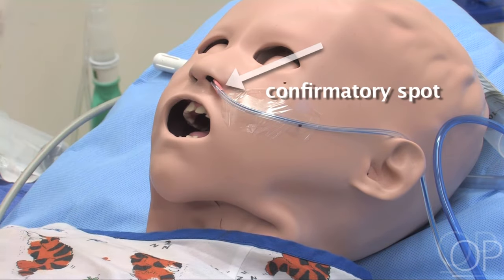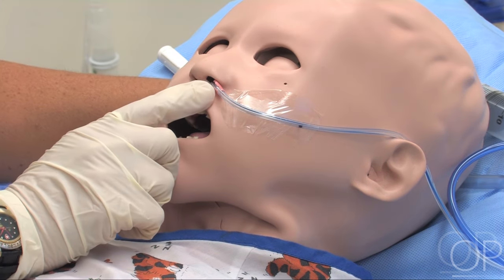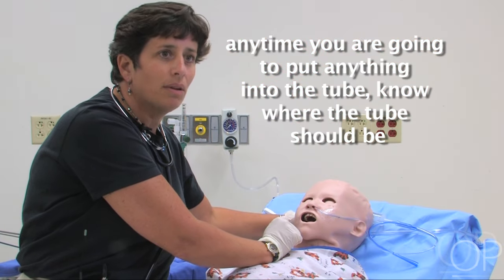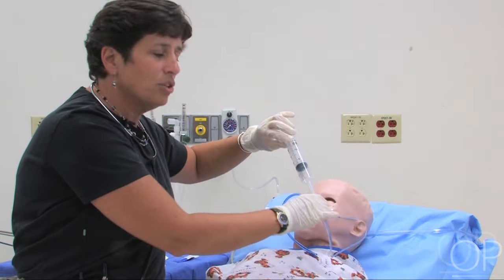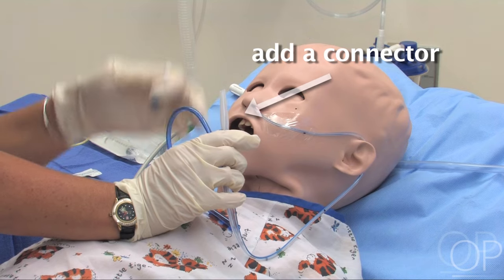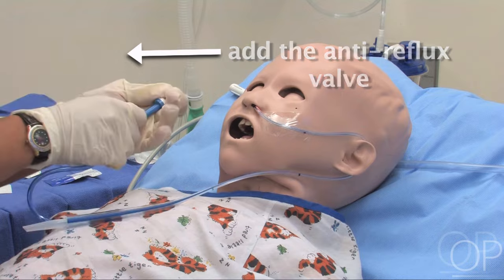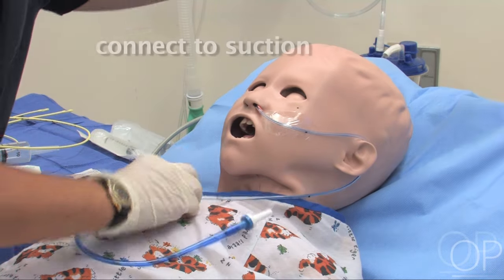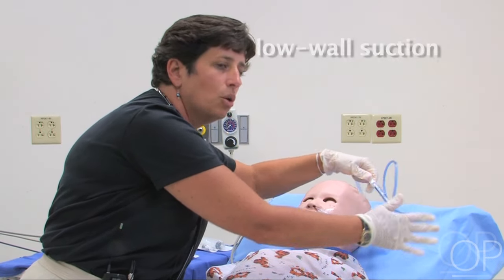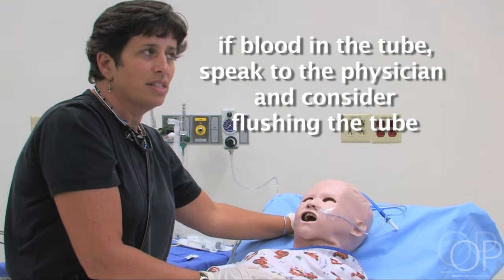As you can see, my confirmatory spot is right there, and it's important to check every time you approach this patient — if you're going to put anything into the tube, know that the tube is where you put it when you first placed it. I'm going to get this hooked up now to suction by adding a connector and putting on the air valve so that he can get air out of his belly. Remember, when hooking up to suction, you want to make sure you're only hooking up to low wall suction, because if the suction is too high it could potentially hurt the mucosa of the stomach.